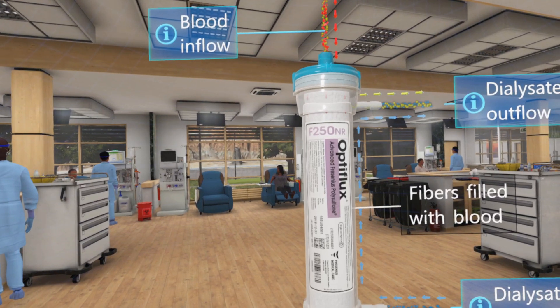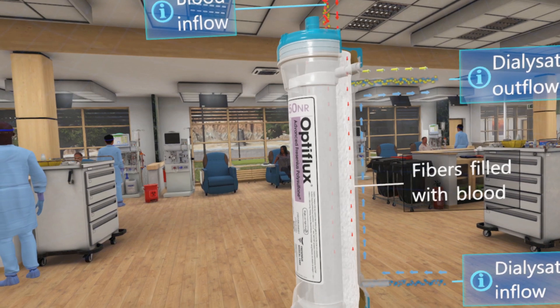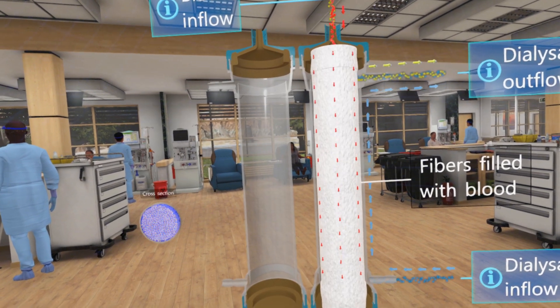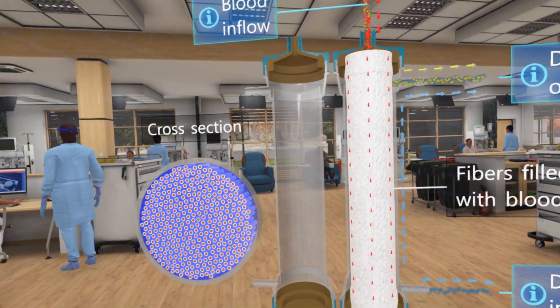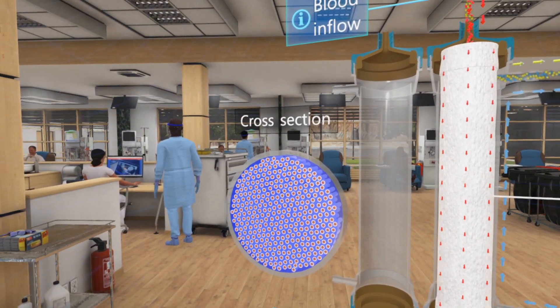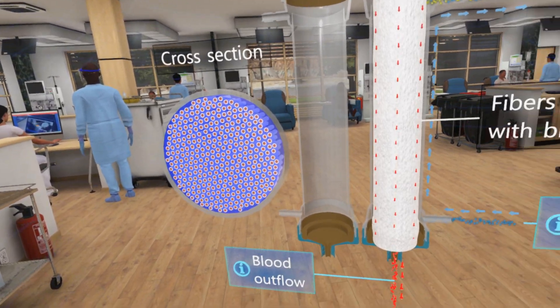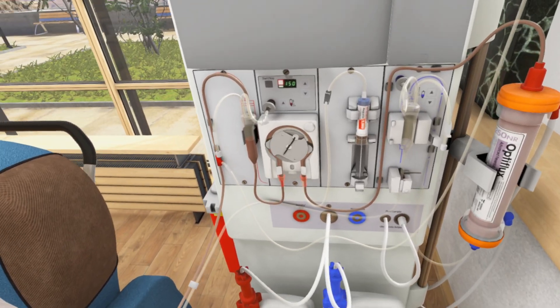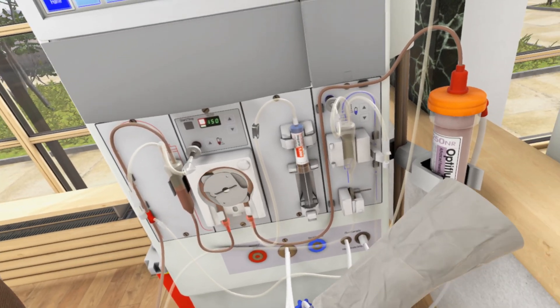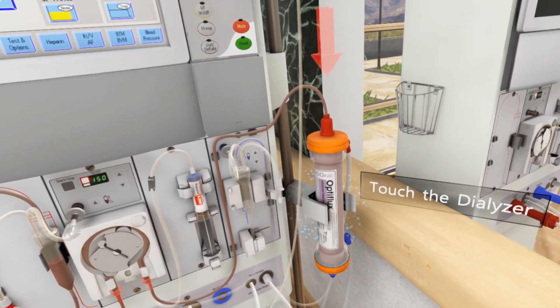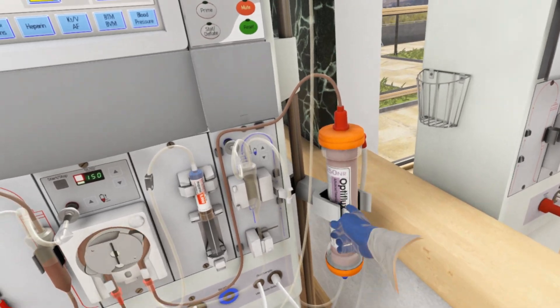At first glance, the dialyzer looks like a simple component of the dialysis machine, but appearances can be deceiving. Please touch the dialyzer connected to the machine and you'll go inside it.